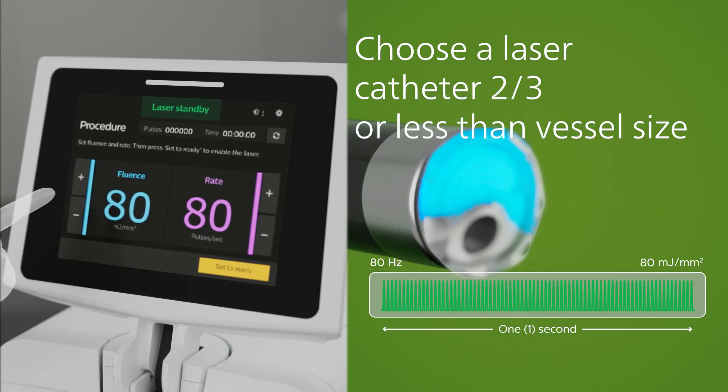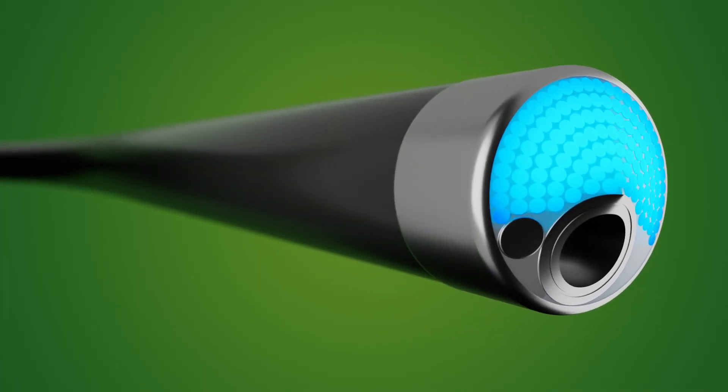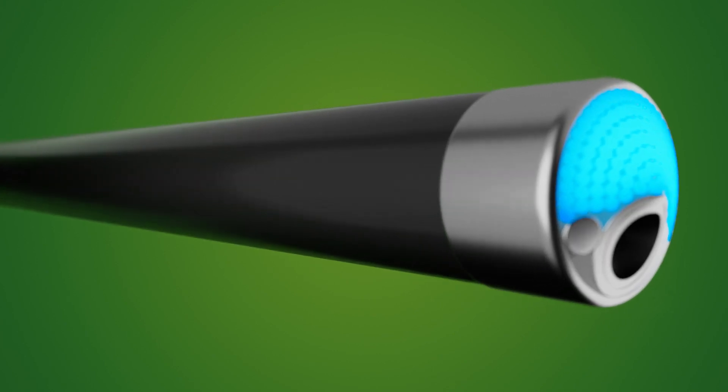At max fluence settings, the cavitation bubble will be approximately 50% larger than the tip of the catheter, maximizing debulking.